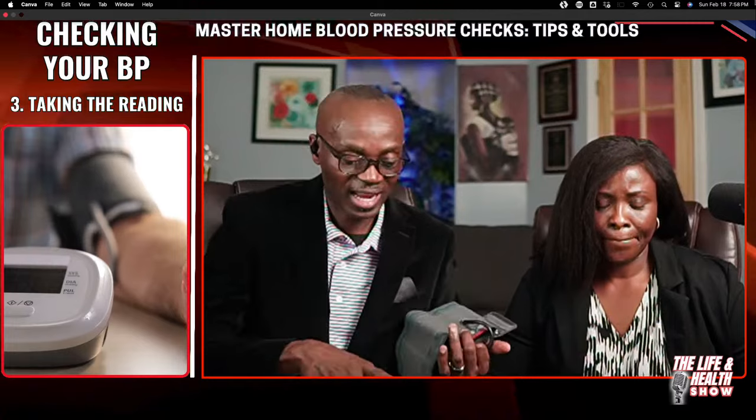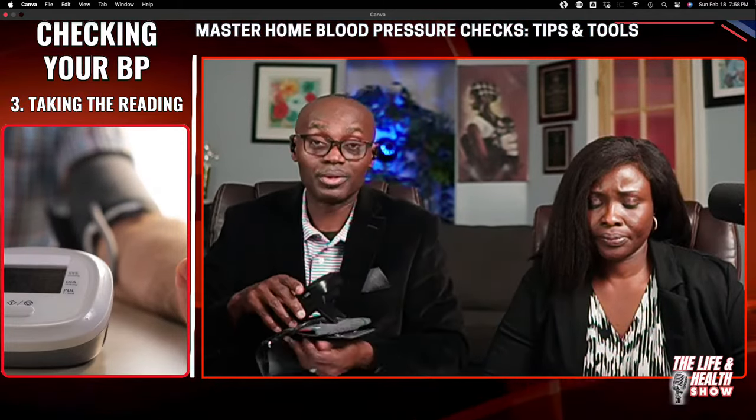It's saying that you have to place your arm on a flat surface, like a table. I think Gifty alluded to using maybe your dining hall table if it is not so high up. But your arm should rest on a flat surface which is able to support you. At the same time, it shouldn't be above your heart level.